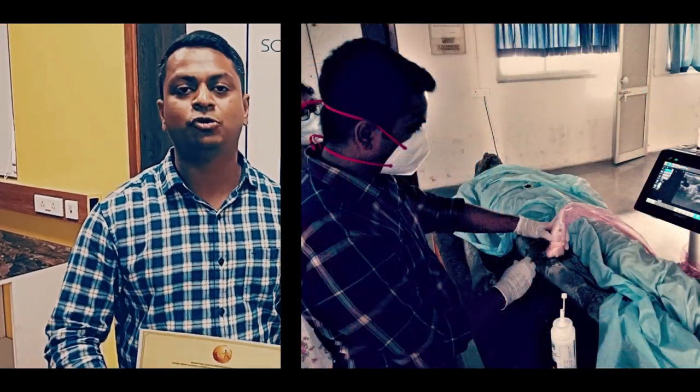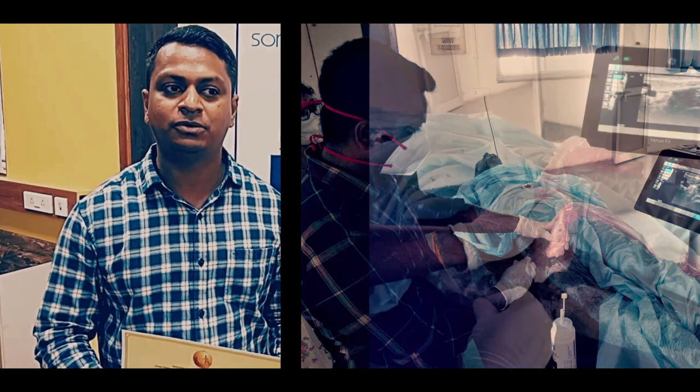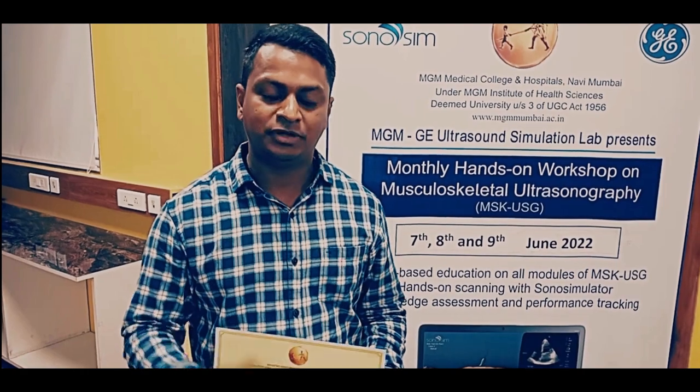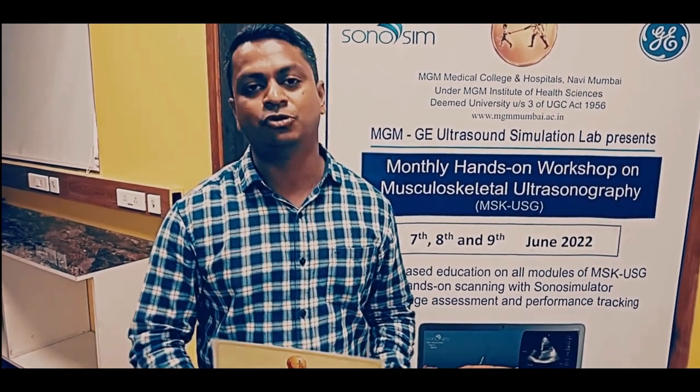I would recommend everyone who is into pain medicine — those who are learning new and those who want to improve their skills in ultrasound — should definitely join this program. It is a must-do program for everyone.